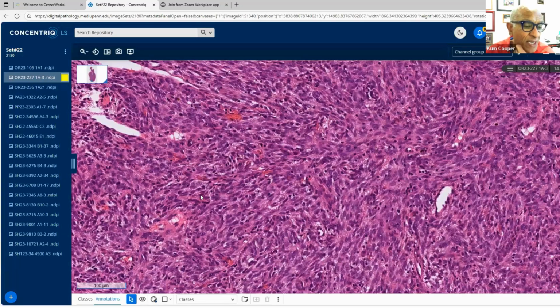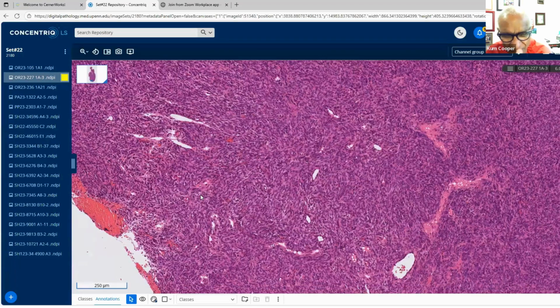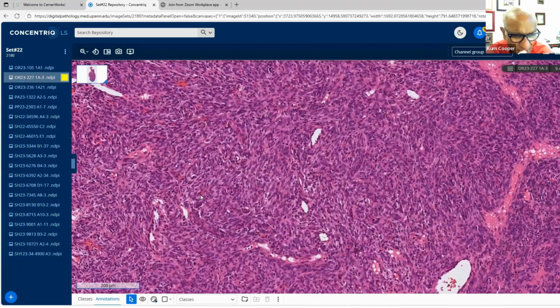I may have told you this in the past, but when I see something that I do not know what I'm looking at, if it's not smooth muscle tumor, if it's not endometrial stroma, if it's not carcinoma, then I ask myself in the uterus, well, what am I looking at? Is this a UTROSCT? Is it a PEComa? Or is it an IMT? Those are the things I keep at the back of my mind because these have now evolved in the last 5 to 10 years as definite, well-recognized tumors in the uterus. So you'd have to do the appropriate markers in that context.